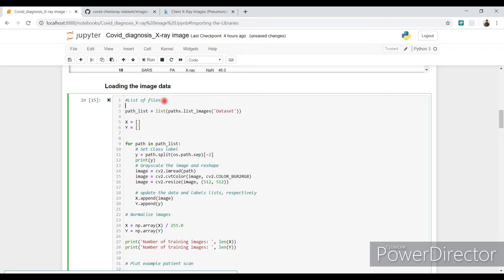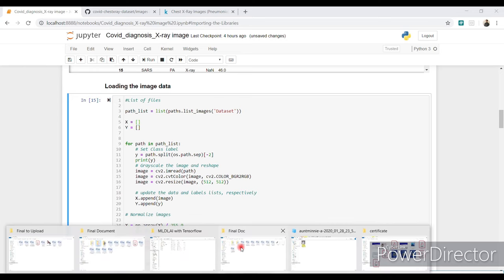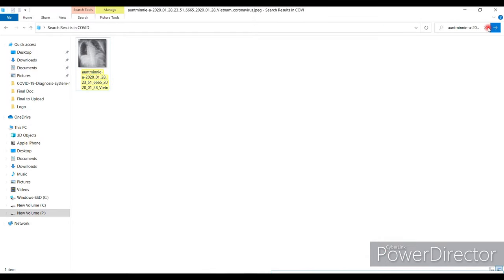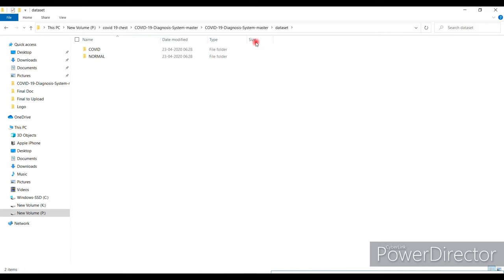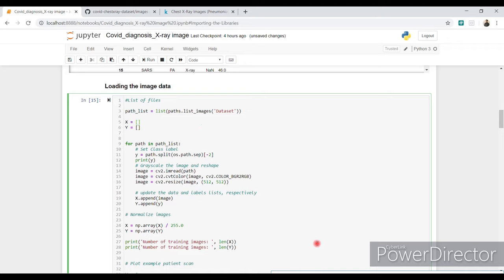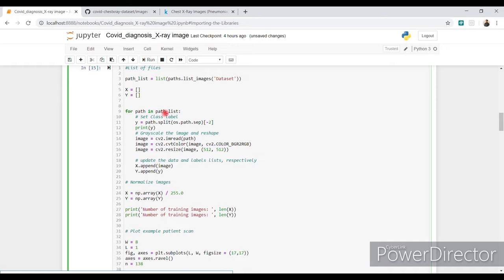Write your path to where you set the dataset. Always keep in mind that the dataset path you declare here must be the same as the actual folder path, otherwise you will get an error. Define two empty lists X and Y. Then loop through the path list — which contains all COVID-19 and normal image paths — storing image labels in the Y variable.